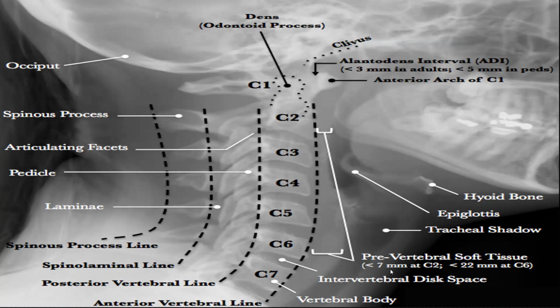So less than 7 mm. If more than that, it means fracture or injury. Clear? Yes, sir.